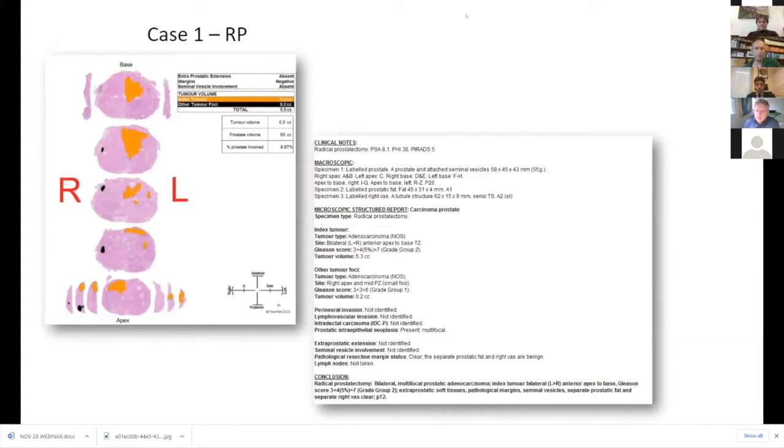I'm keen to answer some of the questions that are coming in because I do want to make it as interactive for our audience as possible, but I obviously won't be able to field all of them. One of them I think is worth fielding. Richard, this is for you. How do you deal with very large prostates with a lot of BPH nodules, some of them with diffusion restriction? How do you sort the cancerous from the benign in that scenario?